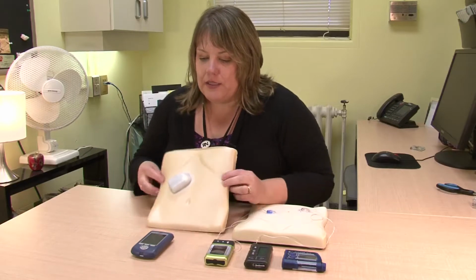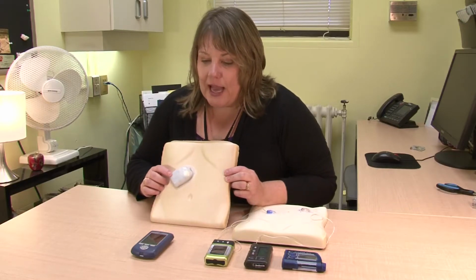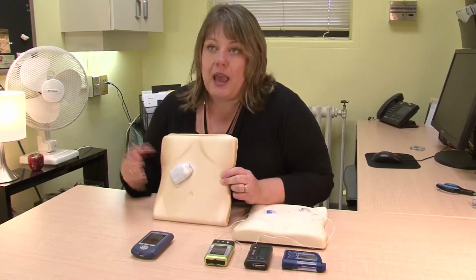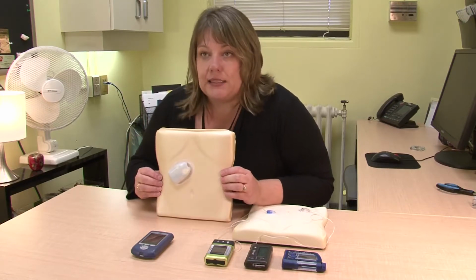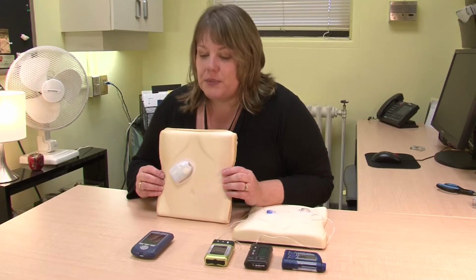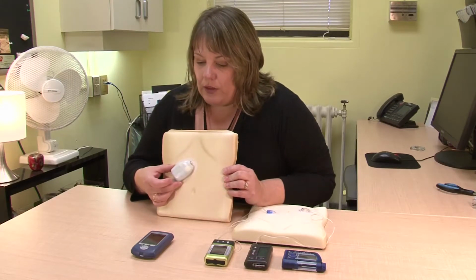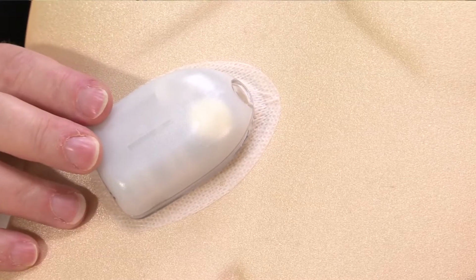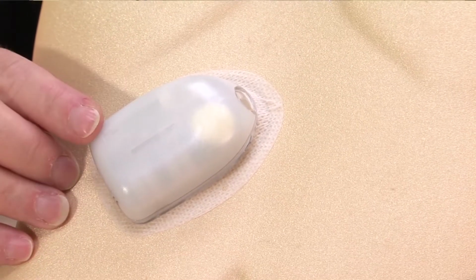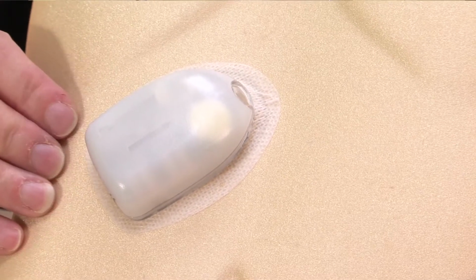This part here is the pod. This is a pod that's actually full of insulin, and it is stuck on a patient, and it can be any place that people would take insulin. It could be on their abdomen, it could be on their arms, their legs, their hips. So what it would look like is it basically just is a pod that's stuck on, and the insulin's being delivered through here. This is like the remote control that controls it.